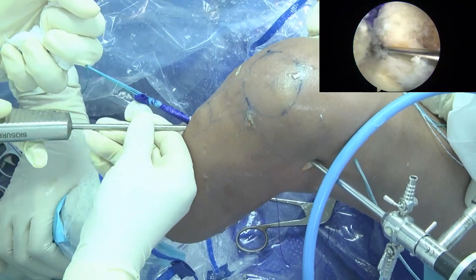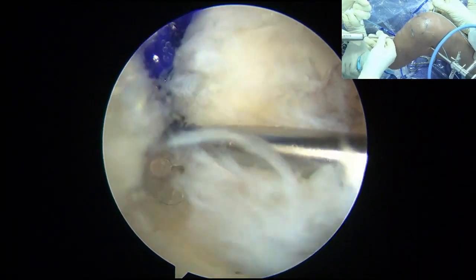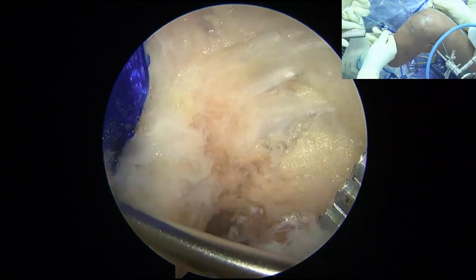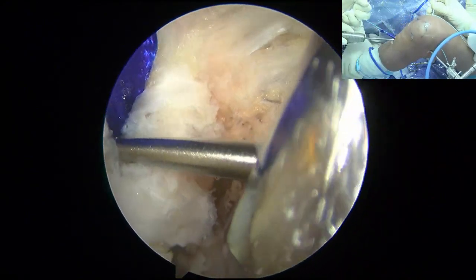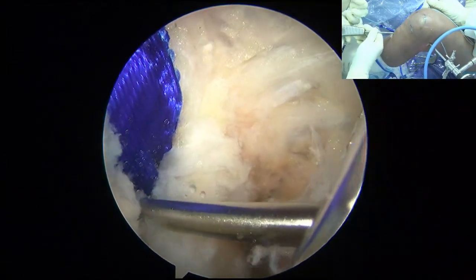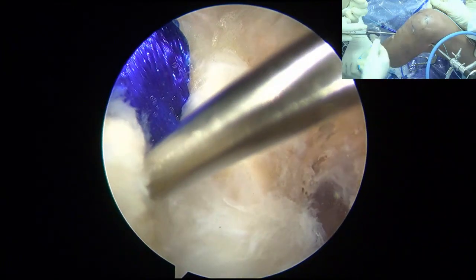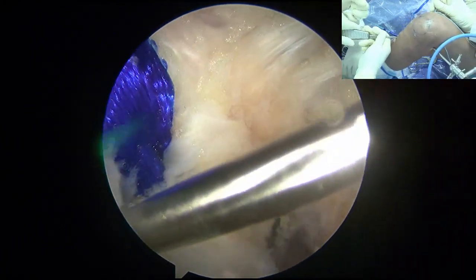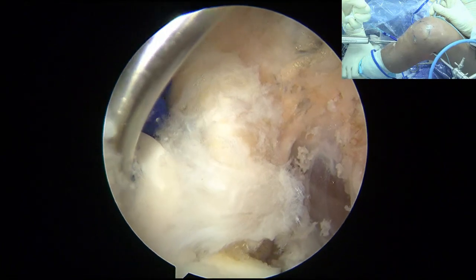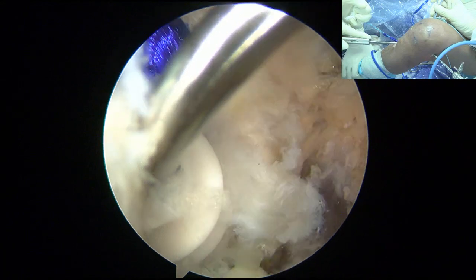Here, it's coming. See my screw? It's coming here, my PCL screw. The PCL screw should be visible soon. So the screw is coming. It's getting deeper. So we prefer to put the screw... Yeah, you see the screw is here. You can see the screw, see here? So this is good.